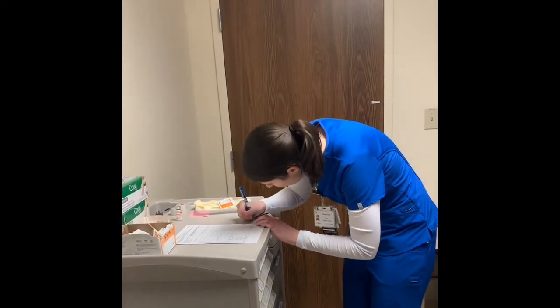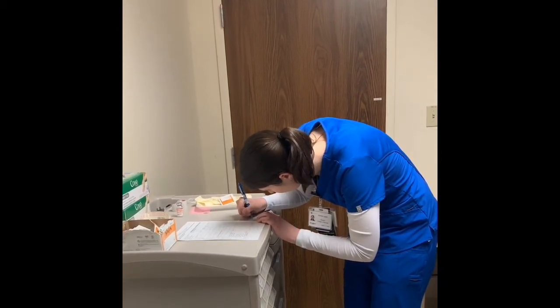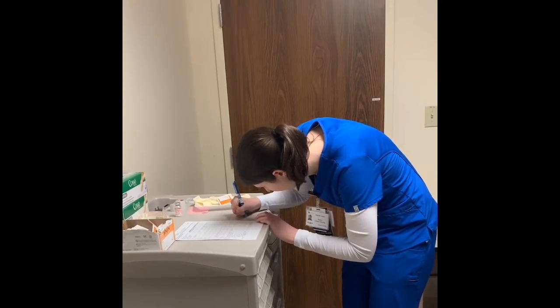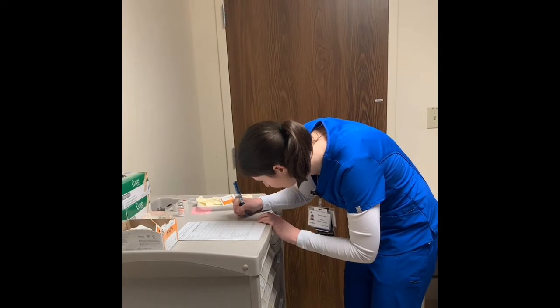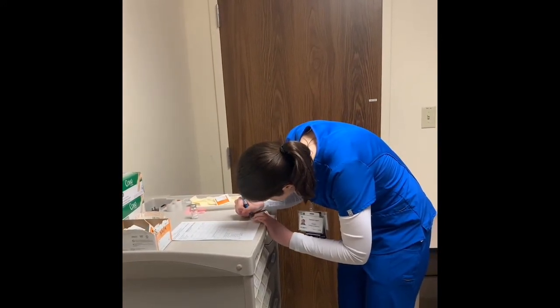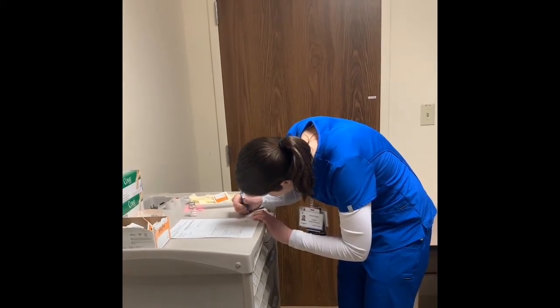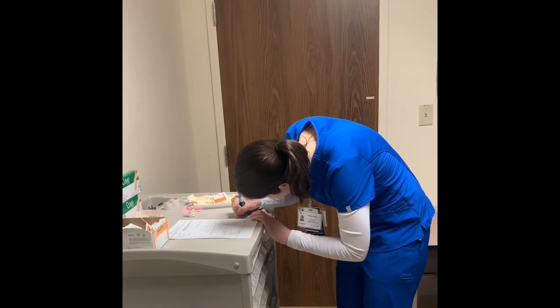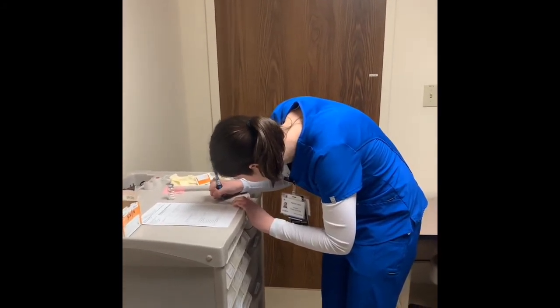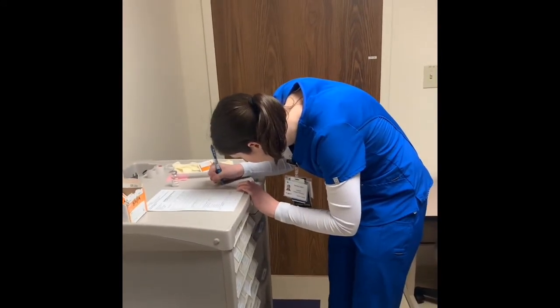So this is for Carmen Guadalupe. It is regular insulin, concentrated at 100 units per 1 milliliter.